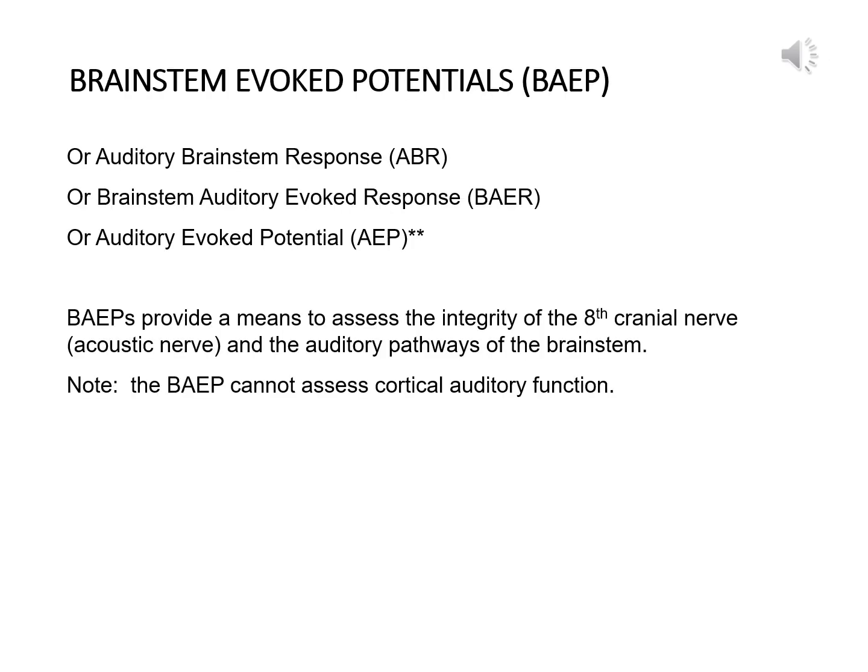The brainstem auditory evoked potential, or BAEP, has several names. It can also be called the auditory brainstem response, or ABR, or brainstem auditory evoked response, BAER. All three of these names refer to exactly the same thing.